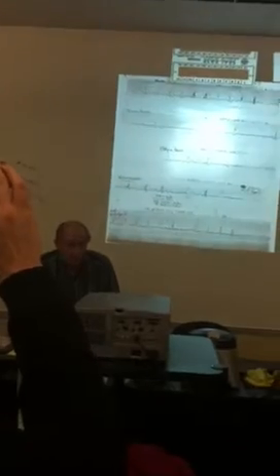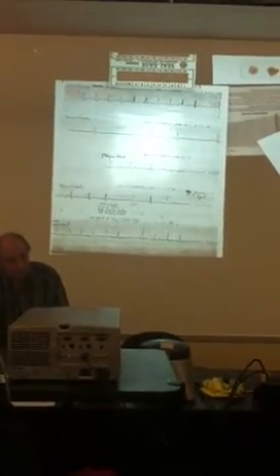These questions answered, where it says, what is an electrocardiogram? That is a recording of the electrical currents that propagate through the heart. That's an electrocardiogram. Propagate means to multiply. A recording of the electrical currents that propagate through the heart.